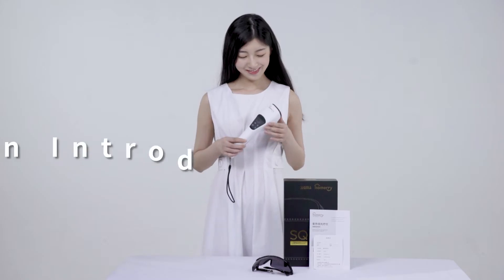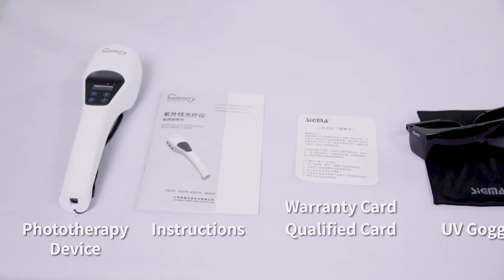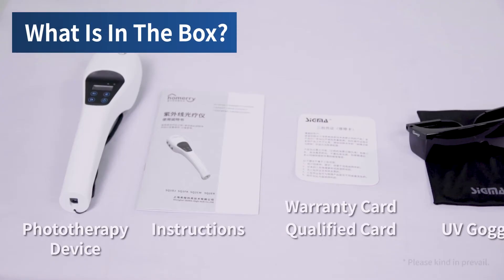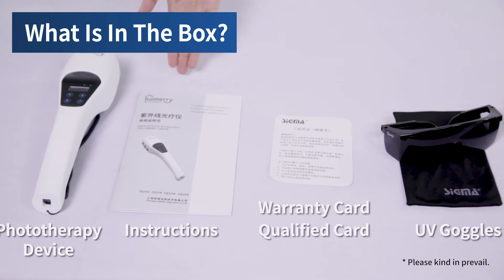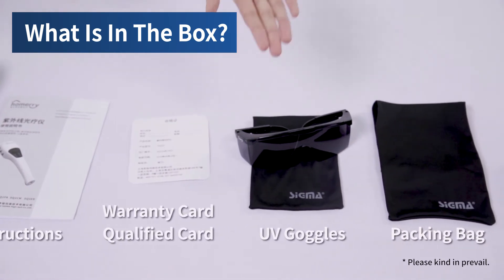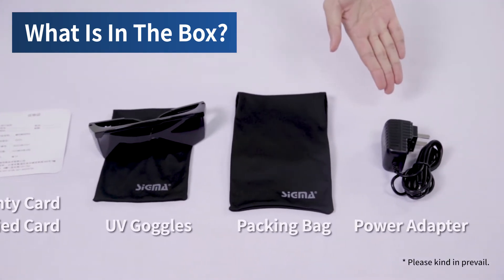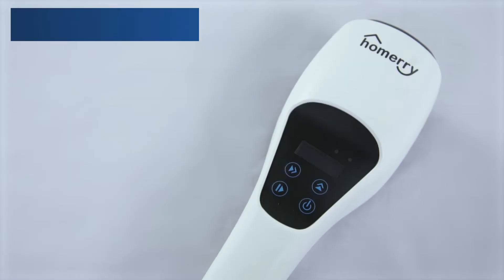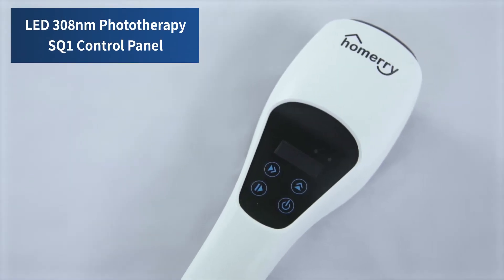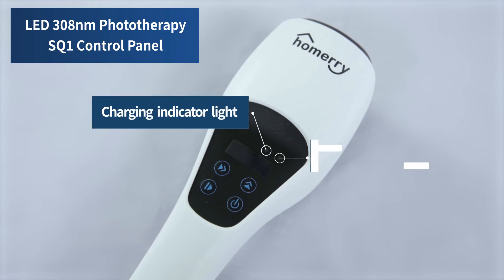An Introduction to LED 308nm Phototherapy SQ1. Packing list includes: Phototherapy Device, Instructions, Warranty Card, Qualified Card, UV Goggles, Packing Bag, and Power Adapter. This is the LED Phototherapy SQ1 Control Panel, featuring a Charging Indicator Light and Working Indicator Light.